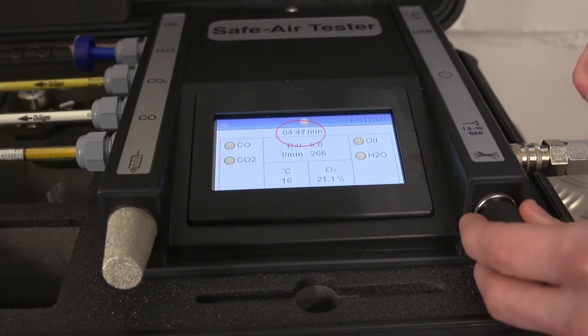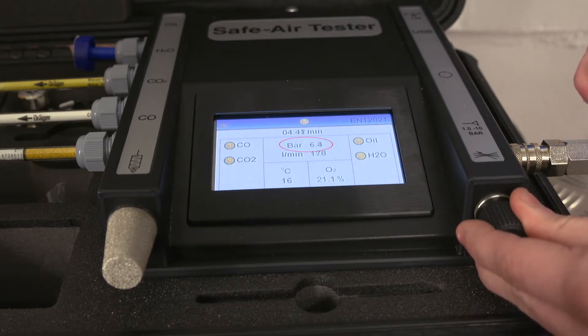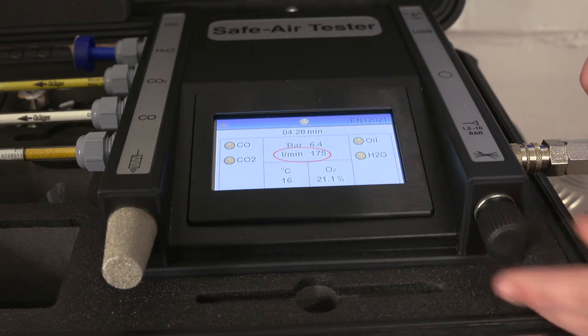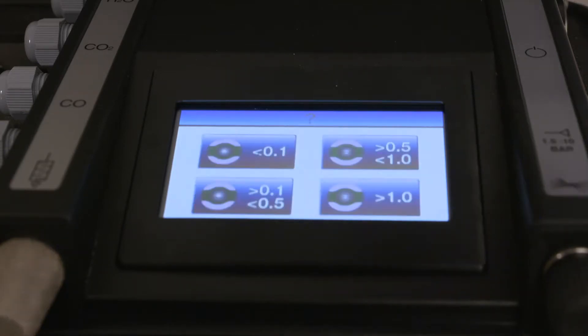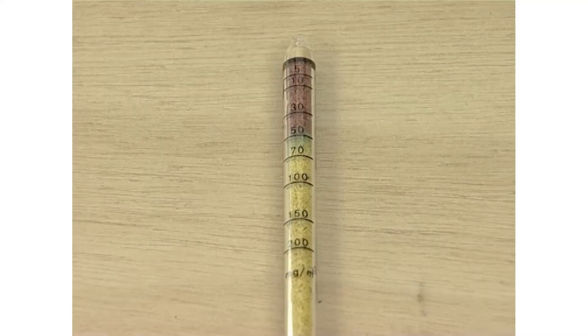The duration will be displayed as a countdown together with ambient temperature, oxygen content and pressure. For airline systems during the test, the flow control valve should be set to the flow rate of the RPD being used, to ensure the system is tested under the same conditions as it would normally be operating. The status of individual tests is indicated on the display — clock symbols indicate tests are active and ticks indicate tests are complete. The unit can be left until the test time has elapsed. Once the test is complete, close the flow control valve. The readings from the three tubes and impactor can now be entered.